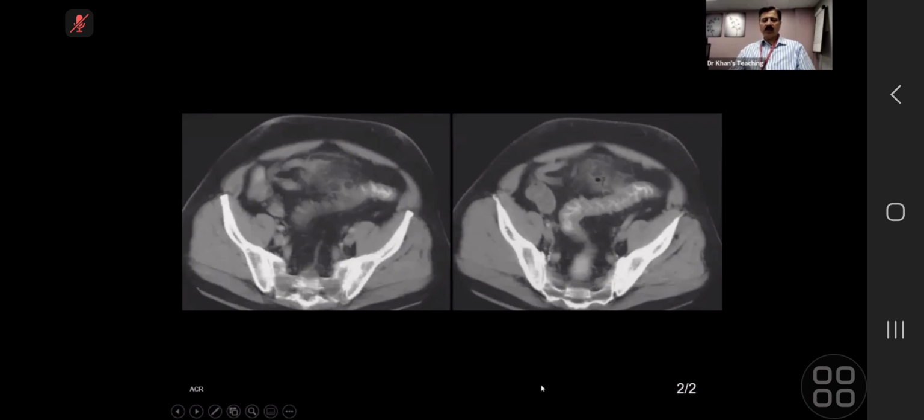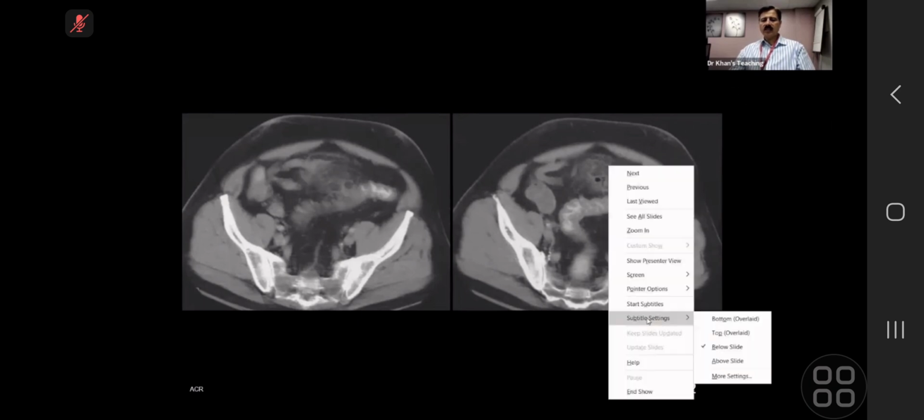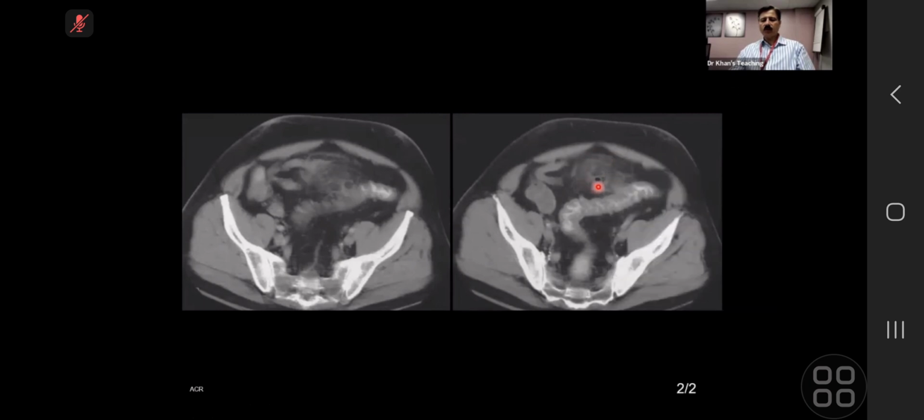Basically, diverticulitis means that there is a perforation of a diverticuli. So initially there must be a perforation, and when that perforation occurs, there might be a locule of gas. This locule of gas is sitting in what we call the sigmoid mesentery, and there might be more than that. So don't overcall it. Don't think that this is pneumoperitoneum, because this is in the mesentery of the sigmoid.